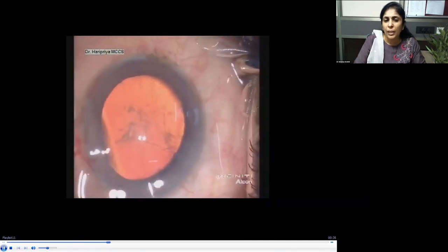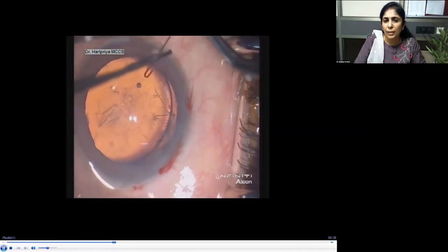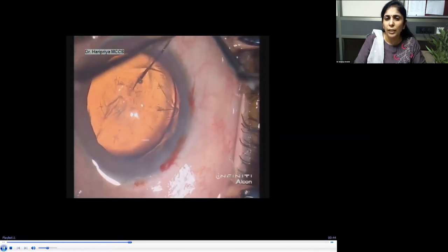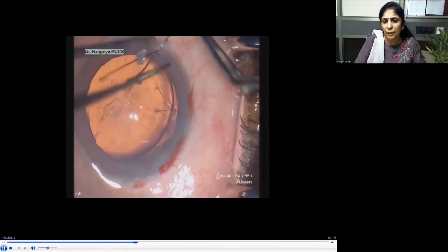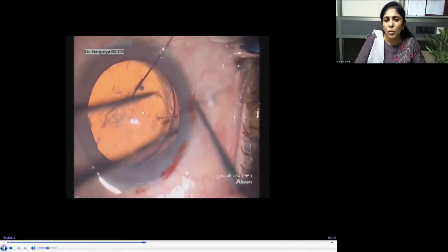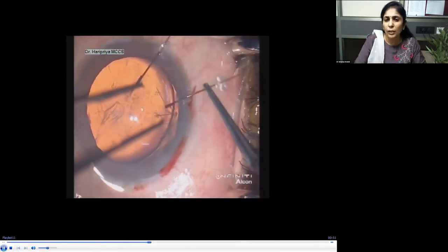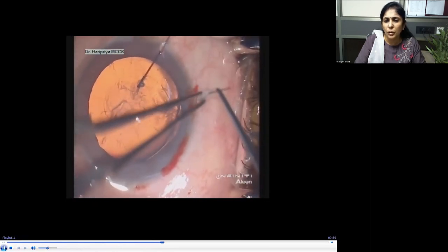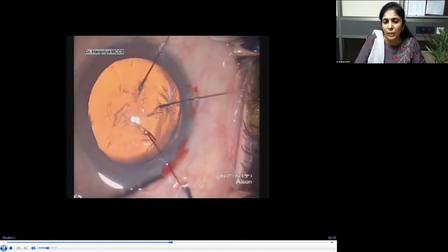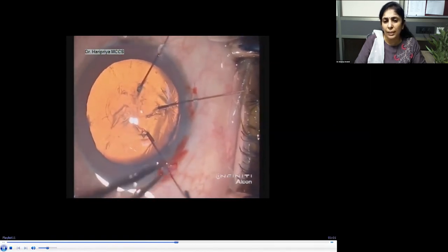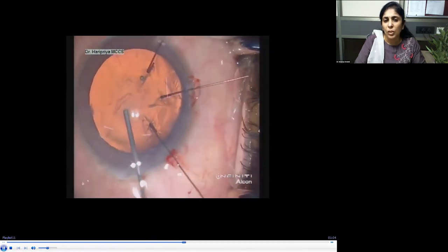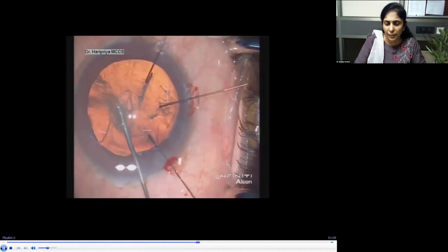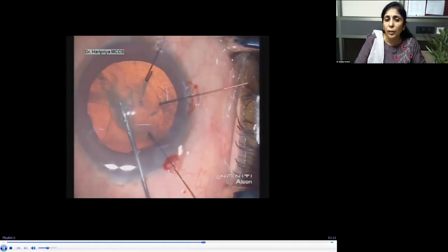Once the hooks are in place, the first thing is to use the hook — a regular iris hook. These are inserted through a 0.67 mm stab incision, about one hook for every two clock hours. In this video they are placed at the limbus, but you can go a little more peripherally and posteriorly when you want to grab the rhexis margin.